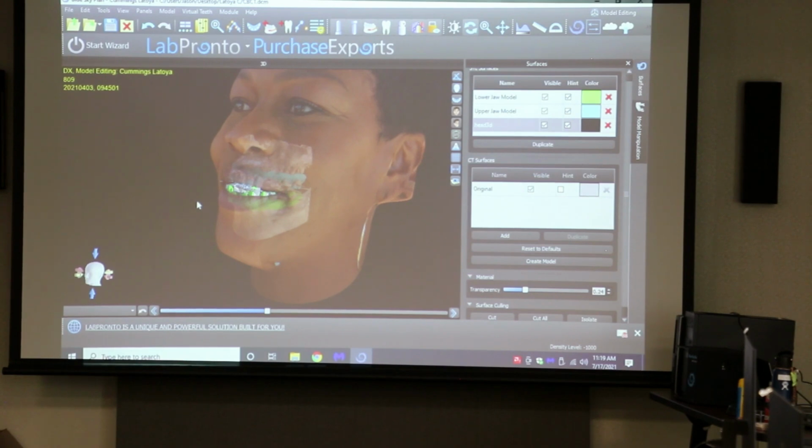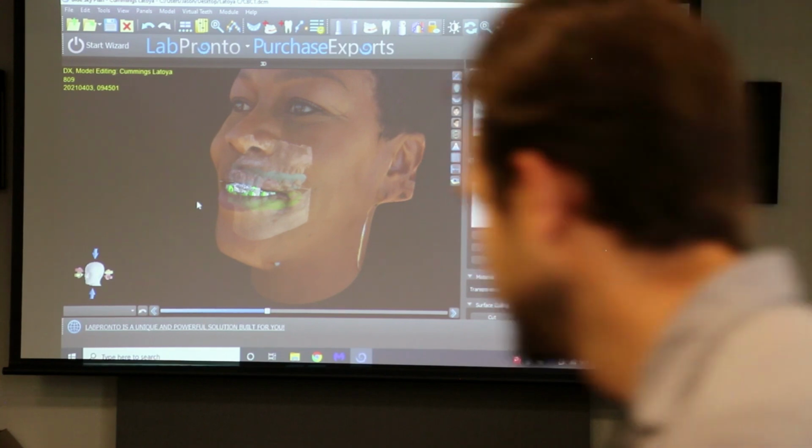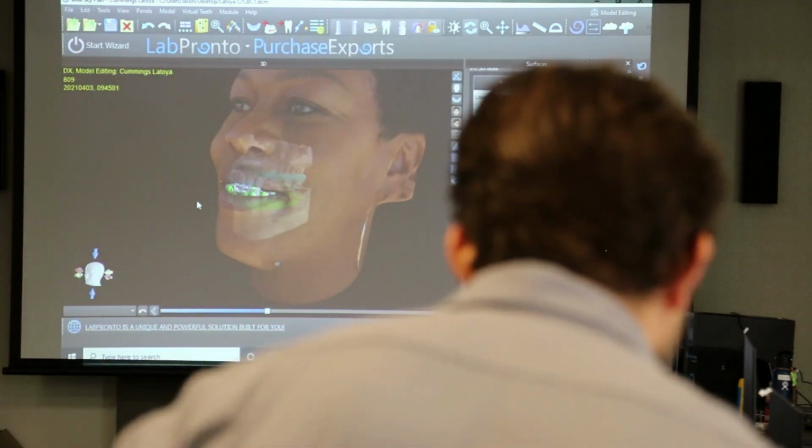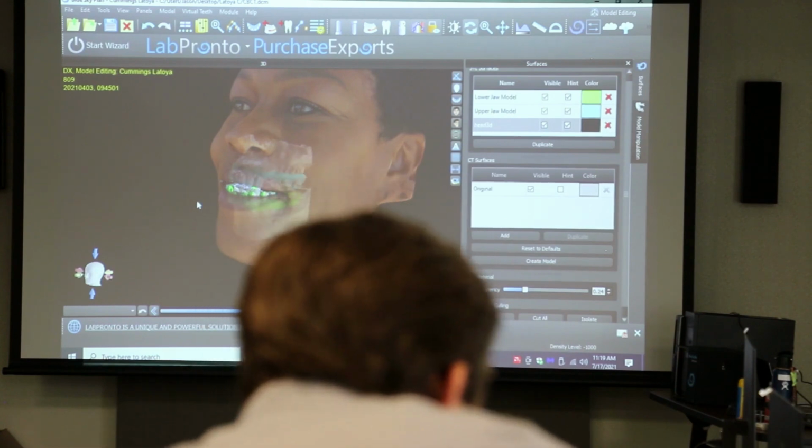I don't think so either. Exactly, and that goes back to making sure that you're controlling the data acquisition. Let's say it's the vertical that you want, and then an exaggerated smile. It's hard to get them to hold a scan. You think you can get the lower jaw aligned with the upper jaw? It's just a little bit of practice.